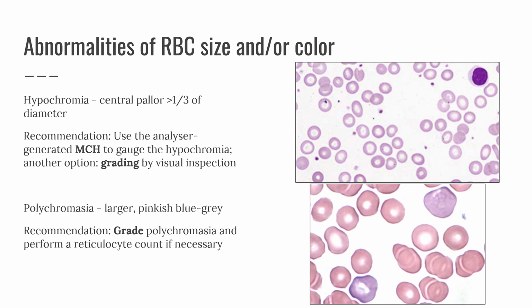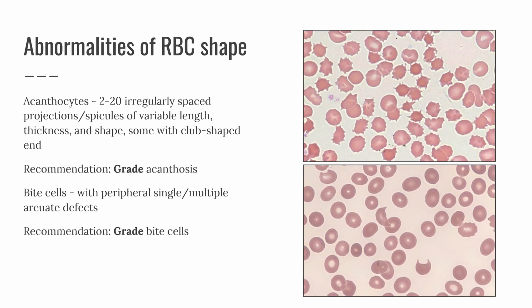By the way, when I say you have to grade certain morphology, I am referring to the table provided by ICSH. For RBC shapes, all these images came from the supplementary images provided by the article, and for most of them, the recommendation is actually to grade each shape.